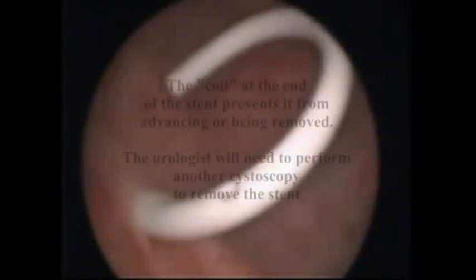These stents will need to be removed at a second endoscopic procedure. Notice the pigtail coil at the end of the stent — this keeps it from accidentally advancing or being removed.